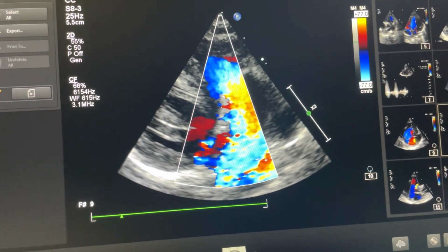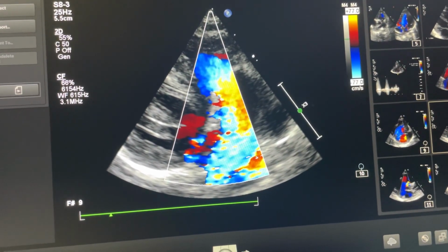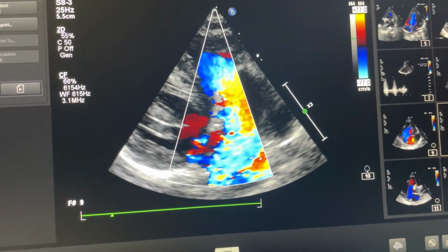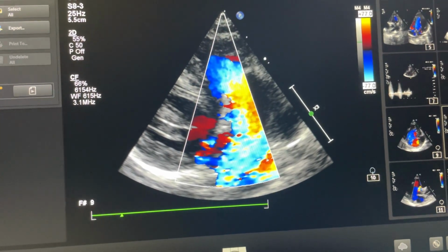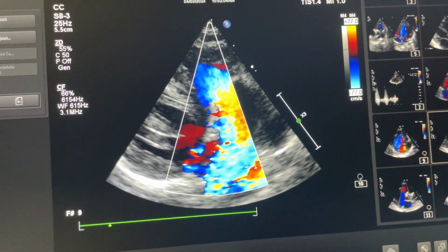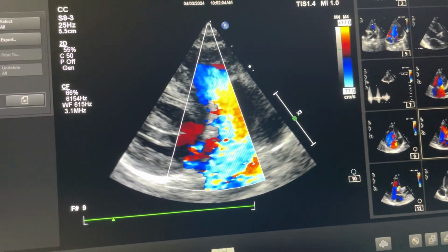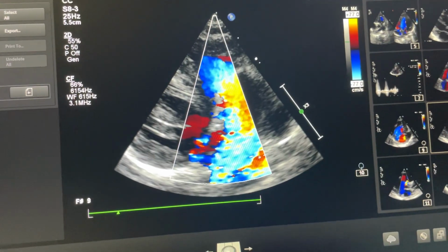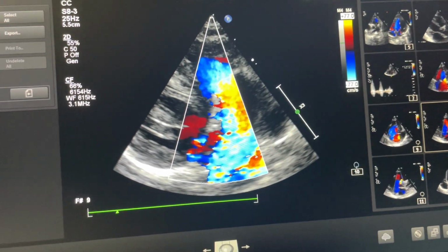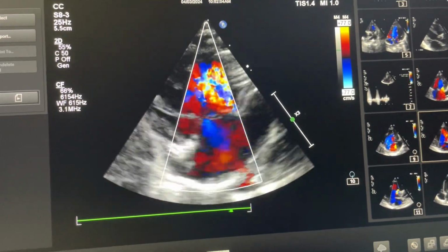pulmonary valve. RV outlet means blood goes out of the right ventricle through the pulmonary valve. So in the parasternal long axis view, if you rotate the probe towards the right ventricle inlet portion and the VSD comes into view, then that is perimembranous VSD. You know the VSD that is close to the tricuspid valve is perimembranous. If the VSD comes into view when you angulate the probe towards the pulmonary valve, angulation is the better term, then that VSD is outlet supracristal VSD. So even in the parasternal long axis view, you can find out whether the VSD is perimembranous VSD or outlet VSD.